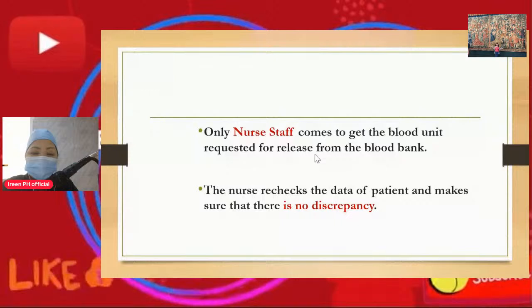Only nurse staff comes to get the blood unit, with a request for release from the blood bank. The nurse rechecks the data of the patient and makes sure that there is no discrepancy.